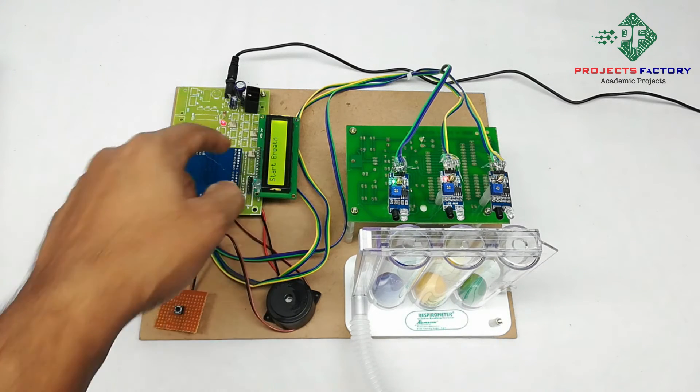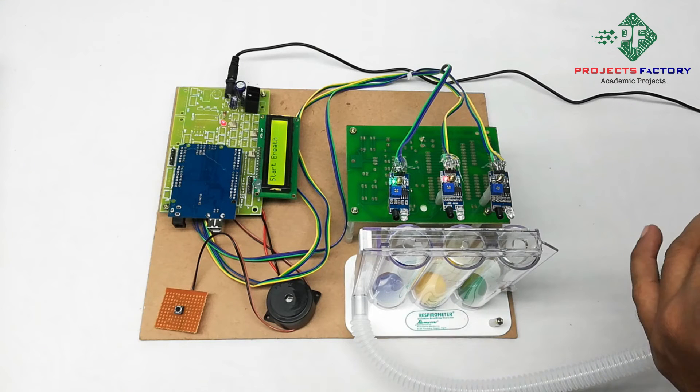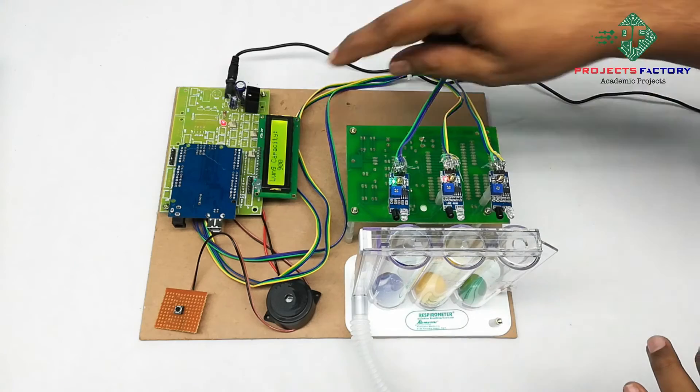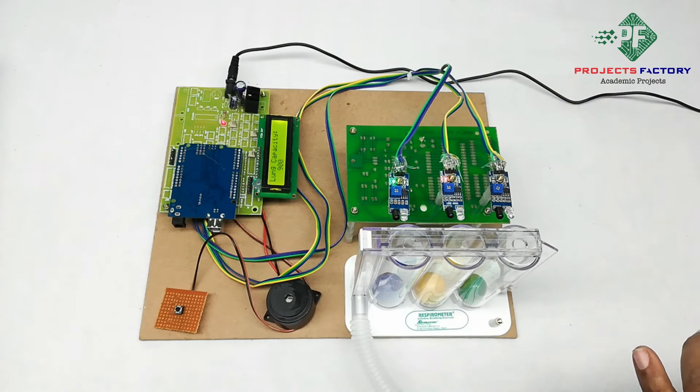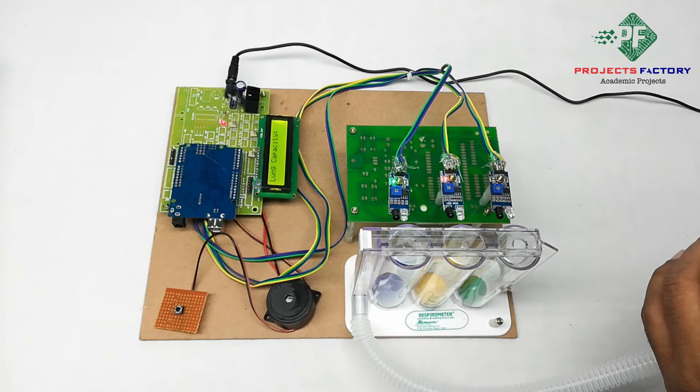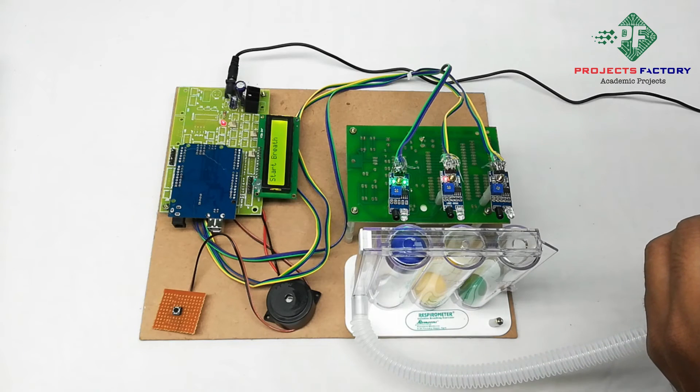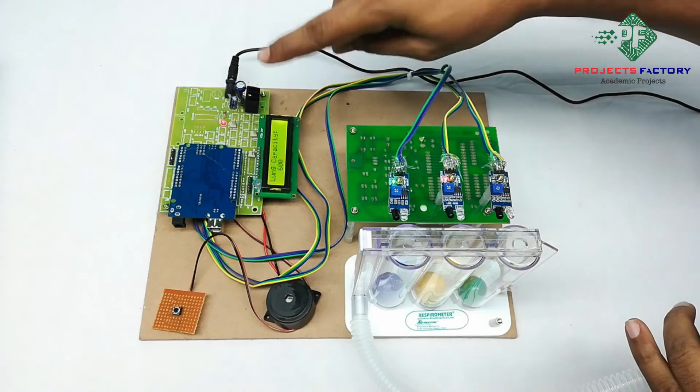It's asking to start breathing. Here we have to hold the breath for at least one second. Then it shows lung capacity - here we can see 900, you can see here 600 for one ball.